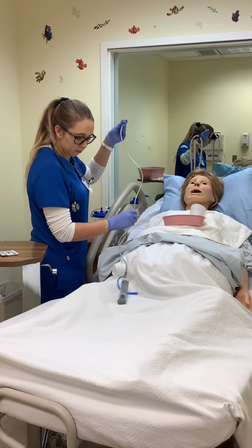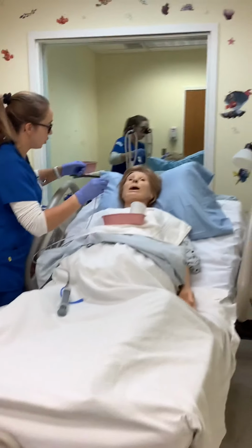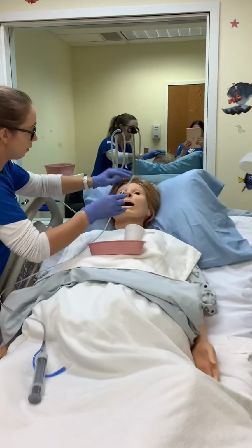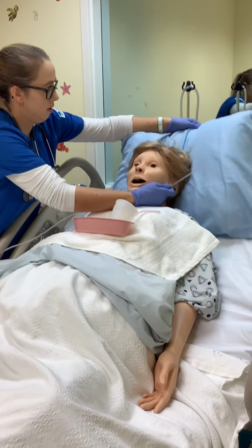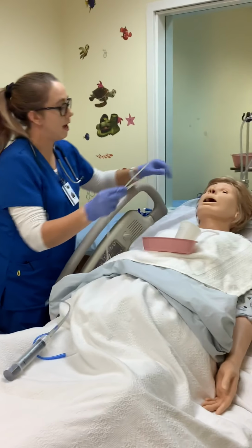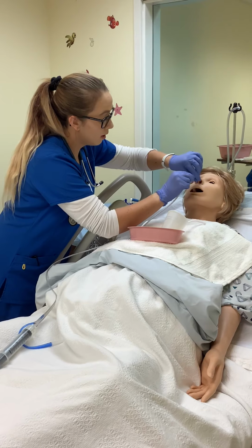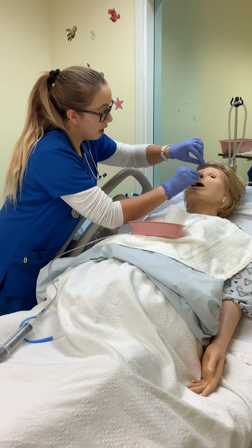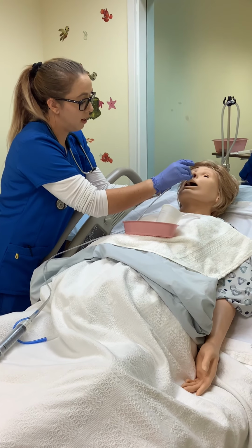Okay, Shirley, I'm gonna have you hyperextend your neck back. Perfect. Probably easier if we get your pillow out of here. There we go. Okay, I'm gonna have you hyperextend your neck and I'm gonna start inserting. Good. Now when you get down to where the patient starts gagging, you want to come back 1/8 of an inch.